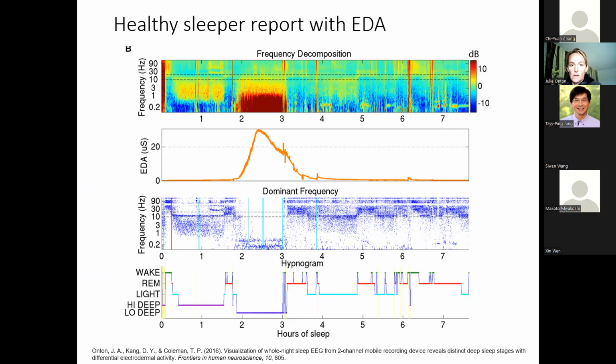They also use EDA to turn the electromagnetic field on and off to help people get into sleep. They turn it off when you are asleep, and when they detect you are in REM sleep or awake, they turn it on so that it will put you into sleep.